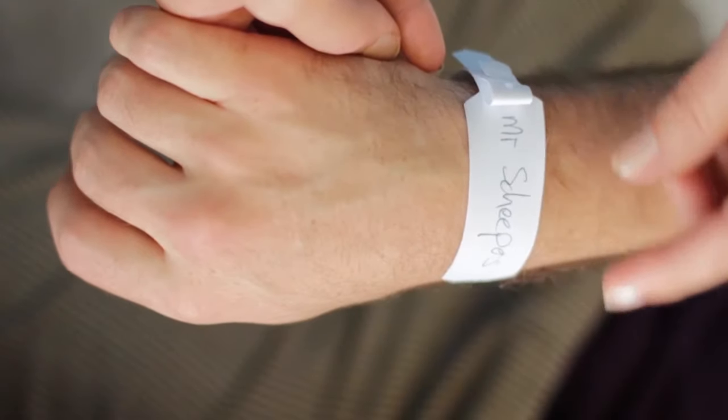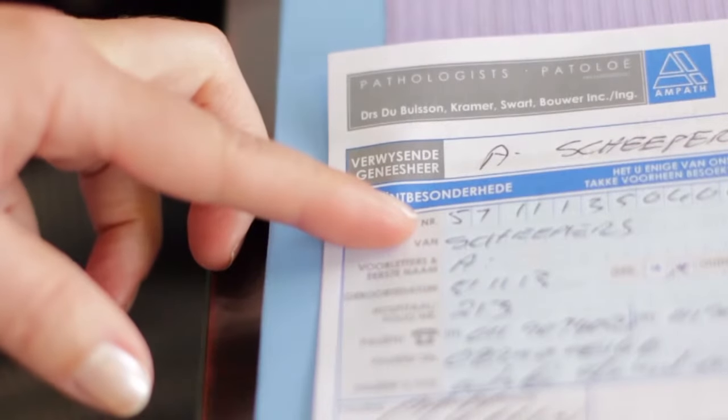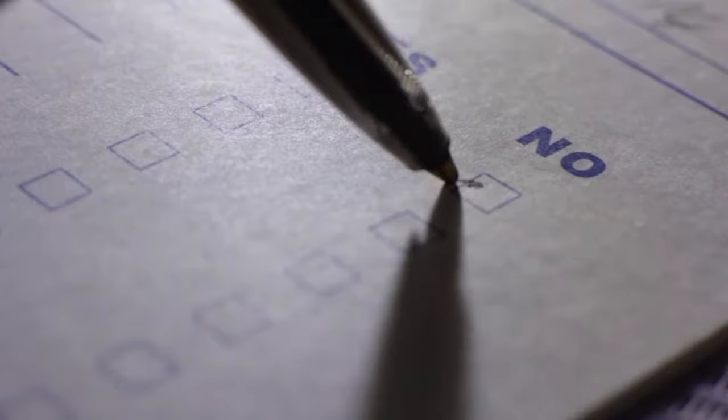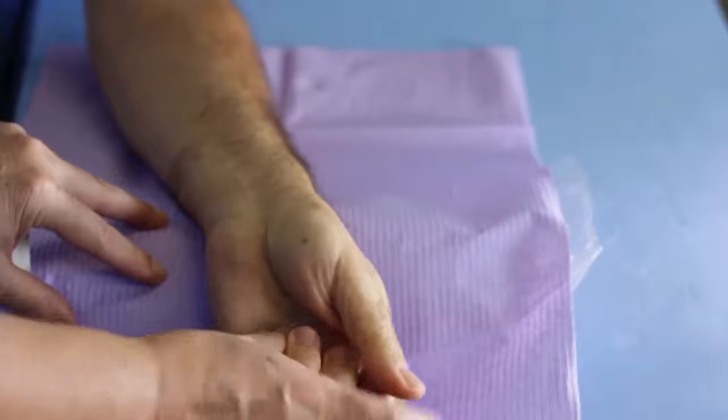Before starting this phlebotomy procedure, first, greet the patient and introduce yourself. Pause to confirm that you have positively identified the correct patient and that you are performing the correct procedure. Second, ask the patient questions regarding possible allergies, bleeding disorders, and ensure that your patient is in a comfortable and suitable position for the procedure.